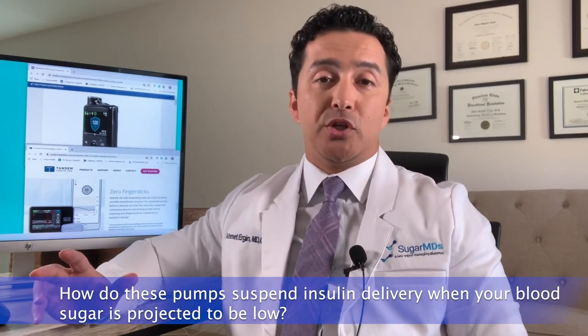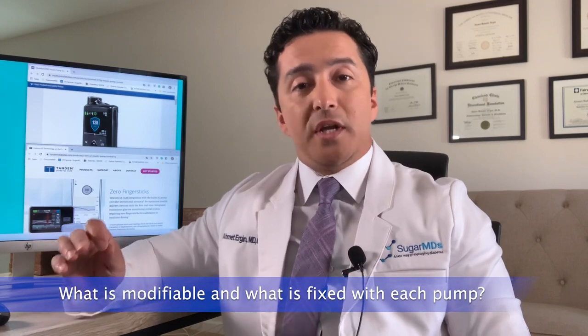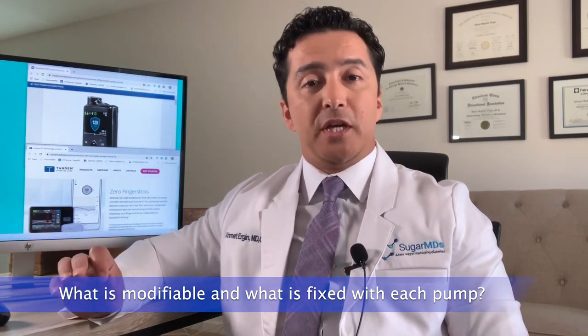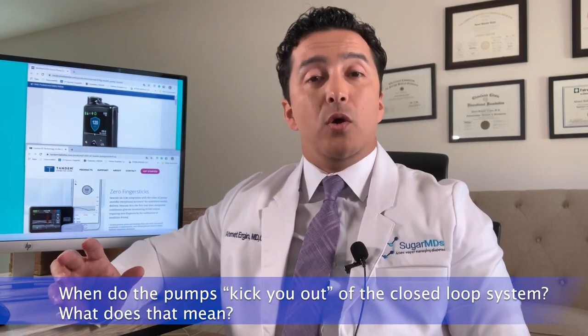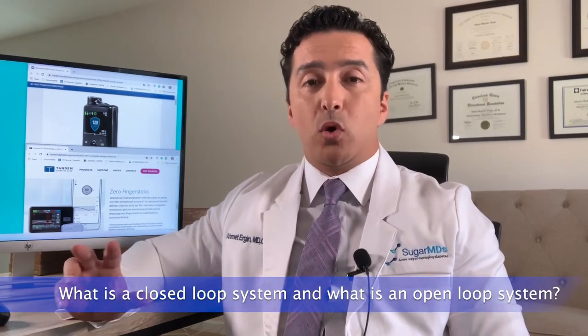Second, we'll talk about what is modifiable and what is fixed in those insulin pumps. Third, we'll talk about when the pump kicks you out of the closed-loop system. We'll explain what closed-loop and open-loop systems are. Fourth, we'll cover educational points you really need to be aware of when wearing those pumps — and that's also true for clinicians who are treating patients with insulin pumps.